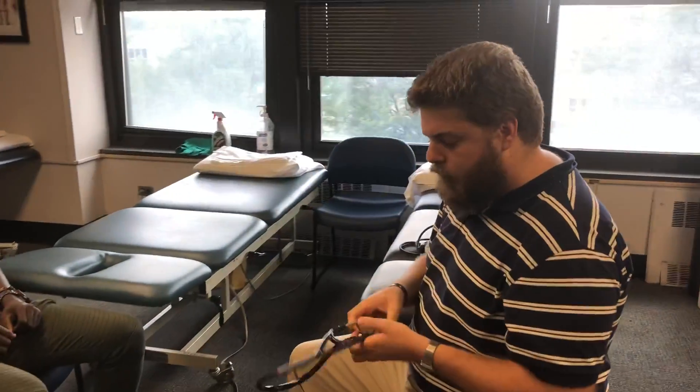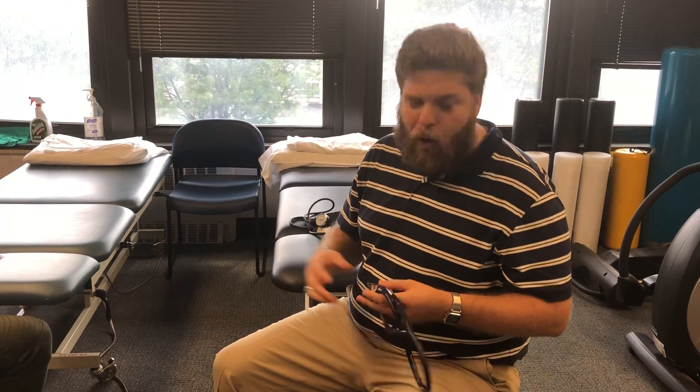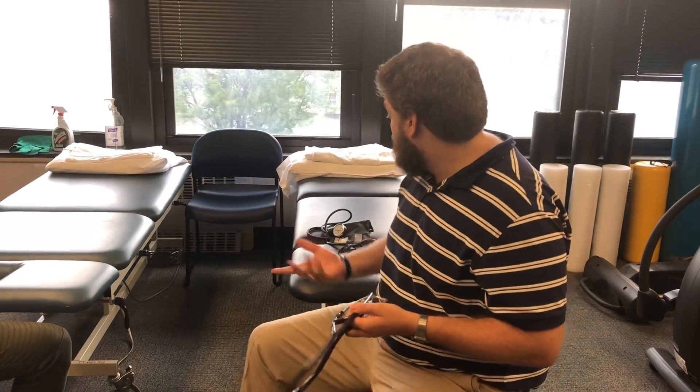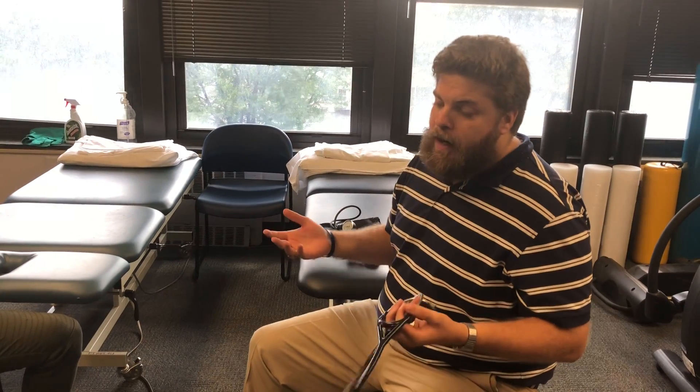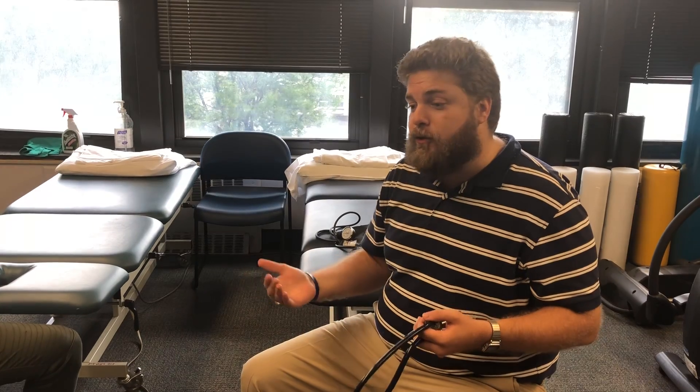A couple things. We always want to make sure that we have our trusty stethoscope. It's a pretty nice one — it's a Littmann device. You don't really need a super fancy one; even a basic stethoscope works. I prefer to manually assess it because while you can use an automatic or oscillometric cuff, you can't use an oscillometric automatic cuff for exercising blood pressure. There are some more advanced devices by Suntech Medical — automatic oscillometric cuffs — but they're like seven to ten thousand dollars per device. So standard manual measurement works really well.